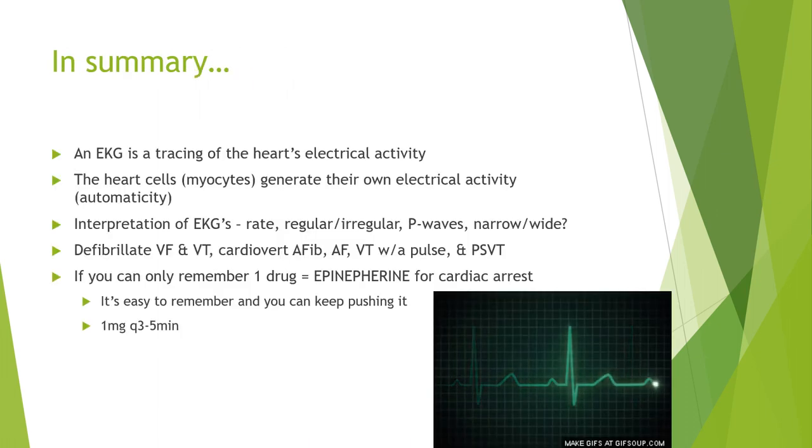In summation, an EKG is a tracing of the heart's electrical activity. We can follow where the electrical impulse starts from the atria and travels down into the ventricles and then repolarizes. If there is a medical condition that is stopping the electrical impulse or creating too many electrical impulses, we'll be able to read it from the EKG.